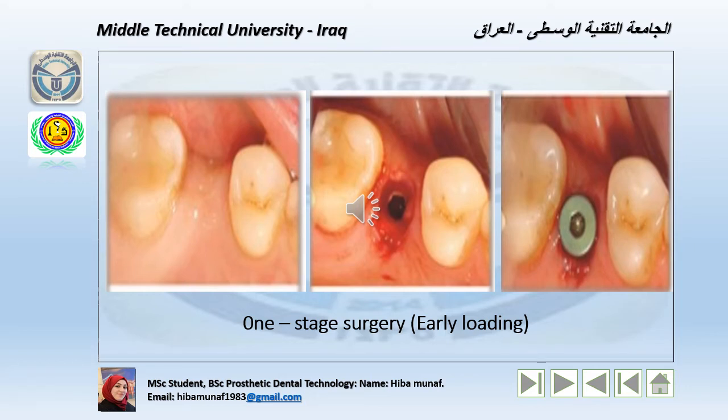one-stage surgery. Number one, this method is placed without surgically opening the gum to have access to the jawbone. Number two, the implant-to-abutment connection may be placed above the crest of the bone. This higher implant-abutment connection may reduce some of the early crestal bone loss. Number three, the prosthetic procedure is simplified with less chair time because there is no secondary surgery. Number four, the prosthetic phase can start earlier because there is no wound healing period.